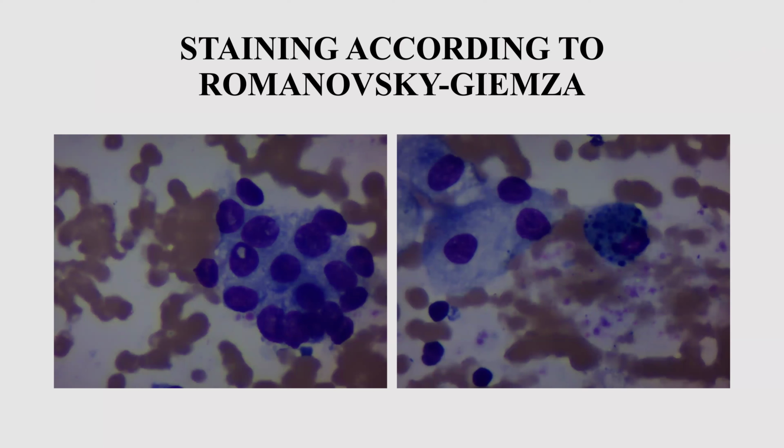And we preserve these tissues, these individual cells from probably a tumor. It's complex, but look at this cell. It is probably a macrophage with some granules inside, because this stain is very sensitive to granular structures, enzymes inside of cells.